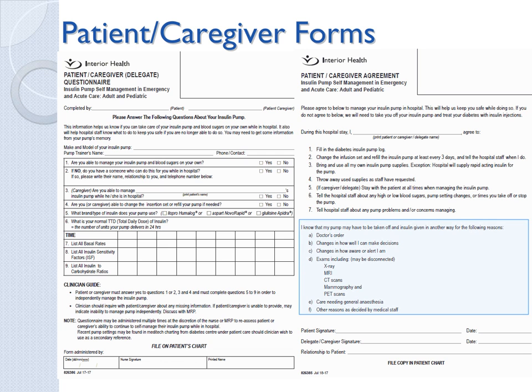The patient will also sign that they understand that the pump may be temporarily disconnected or discontinued based on an impairment in their judgment or level of consciousness, or when they need certain procedures such as an MRI, PET scan, mammography, or CT scan, or for any other reason deemed necessary by the medical staff.